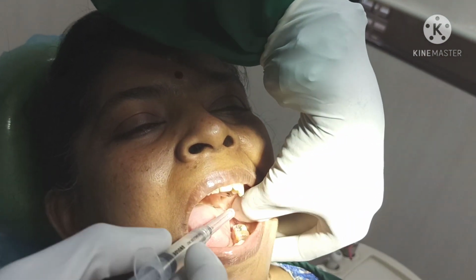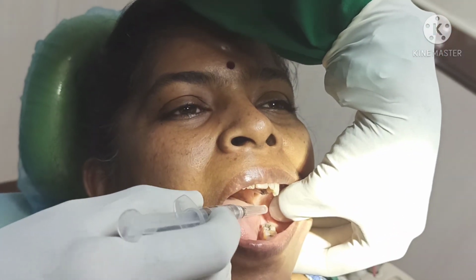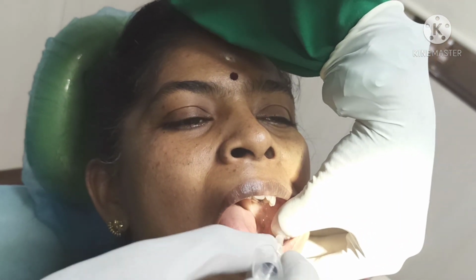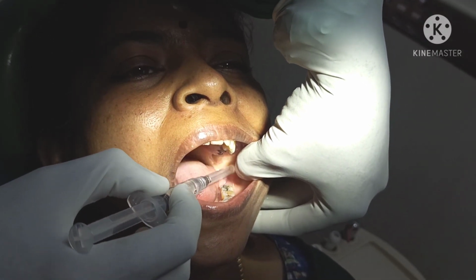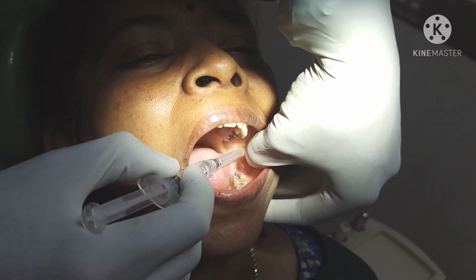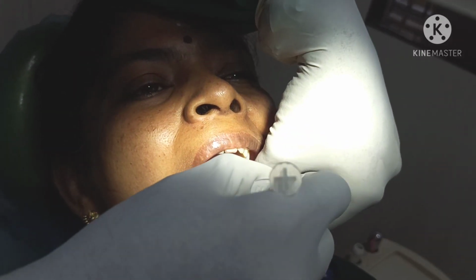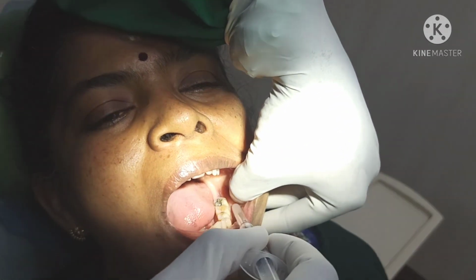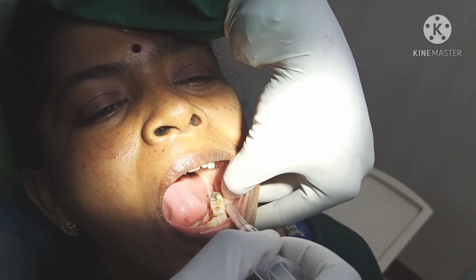I will say one more time. If you are planning for any endo or root canal, only the inferior nerve block is enough. There is no need for any long buccal. Long buccal is needed when you are planning for any extraction or any gingival surgeries on the buccal side. Basically, the long buccal nerve comes from here, along the anterior border of the ramus, and it enters the buccal sulcus here, and it supplies the buccal gingiva of 8, 7 and 6.